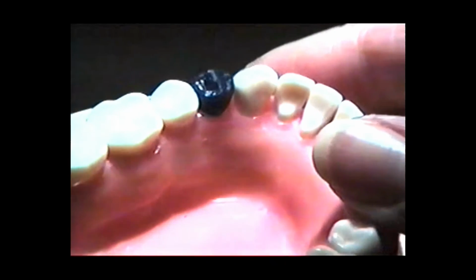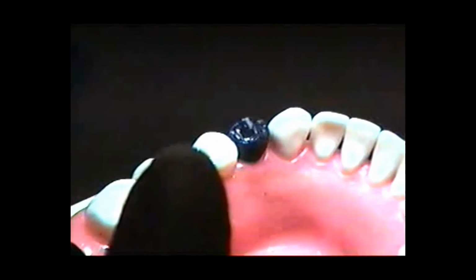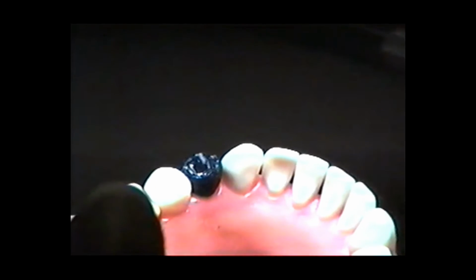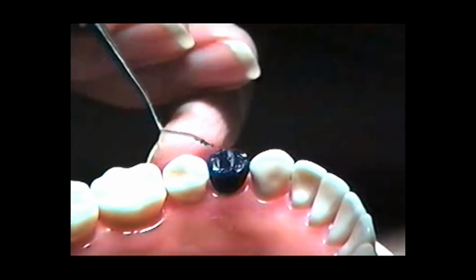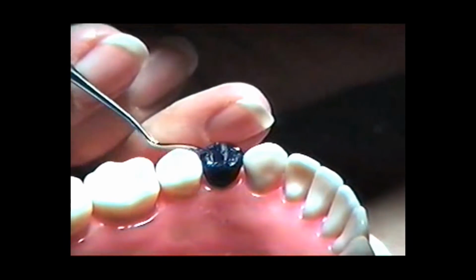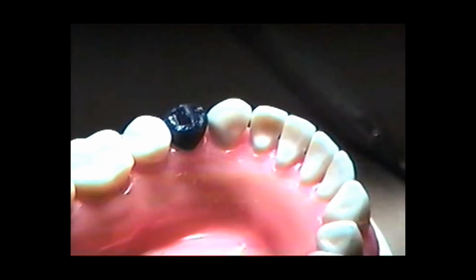Now, I don't know if this is going to show up, but I'm going to show you how I carve the groove pattern on this tooth, and how I check the marginal ridges and make sure they're where I want them to be. Basically, for the marginal ridges, if you have a lot of wax to remove, I just lay my instrument on the adjacent marginal ridge, and I start carving down till I'm down to the level of that marginal ridge. What I've got here is I'm pretty close to that. Then I want to develop an embrasure space in that marginal ridge. And so just give me a second, I'm going to try and screw this in here.